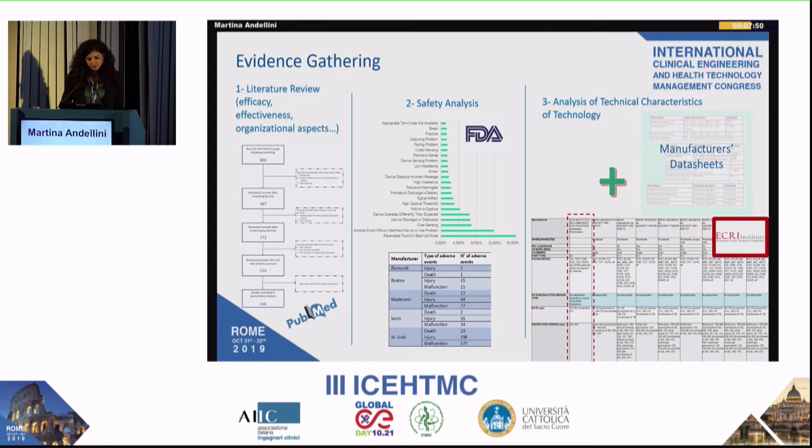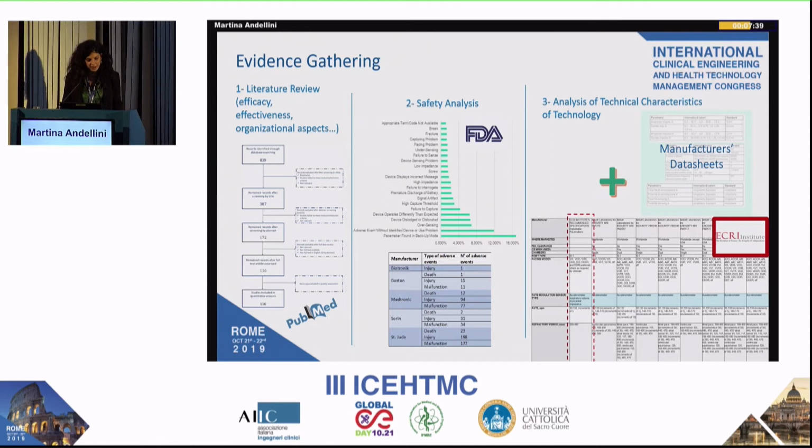So we took into account the FDA MAUDE database, and we identified all the types of adverse events and the number of adverse events related to pacemakers from different manufacturers from 2014 to 2018. And the third step was the analysis of the technical characteristics of the technology.